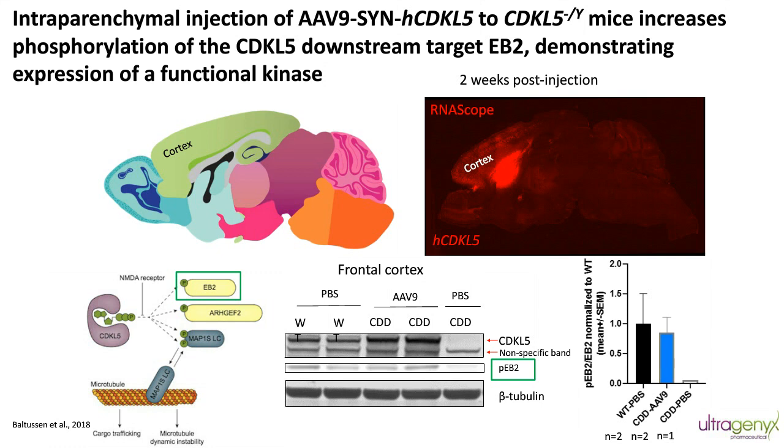This is a technology produced by ACD Bio, which Anushka will talk about after this particular part of the webinar. It really gave us some power that we wouldn't have had without this technique. What we wanted to do was see where this virus was going and where it was actually transducing cells, creating mRNA, and creating protein. However, there's no good antibody currently available that allows us to look for protein levels of CDKL5. So with RNAscope, we're able to look at the next best thing, the mRNA.